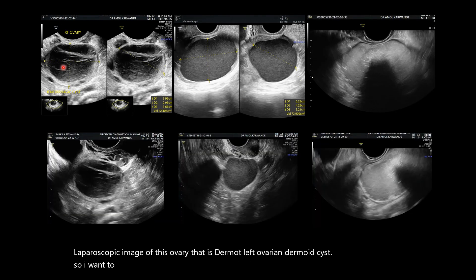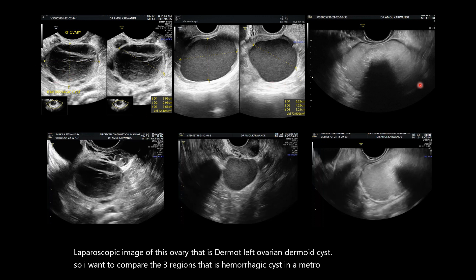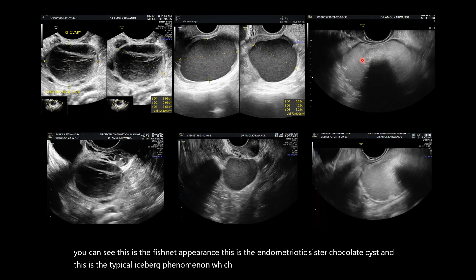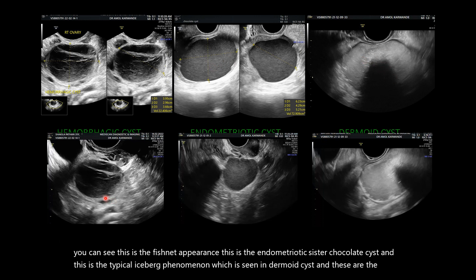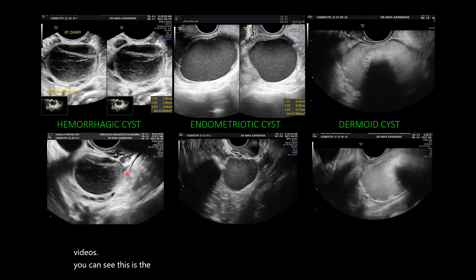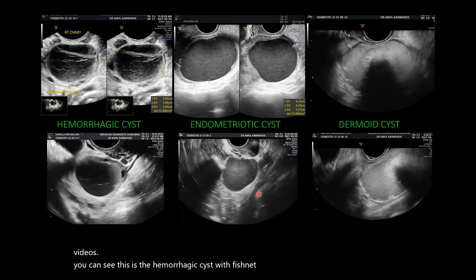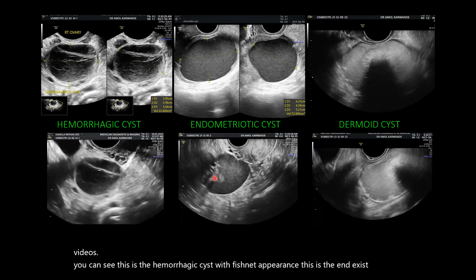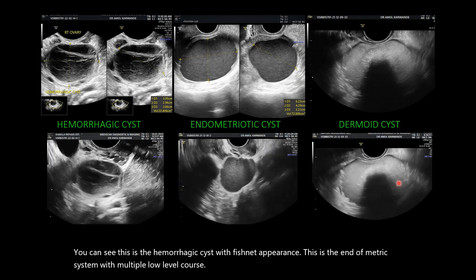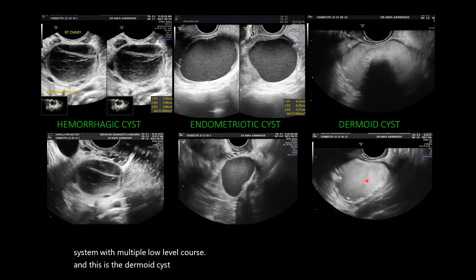Now comparing these three lesions — hemorrhagic cysts, endometriotic cysts, and dermoid cysts. The hemorrhagic cyst shows the fishnet appearance. The endometriotic or chocolate cyst shows multiple low-level echoes. The dermoid cyst shows the typical iceberg phenomenon. These three videos summarize the classical ultrasound appearances of each lesion.